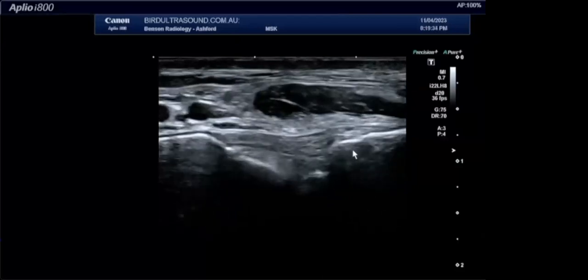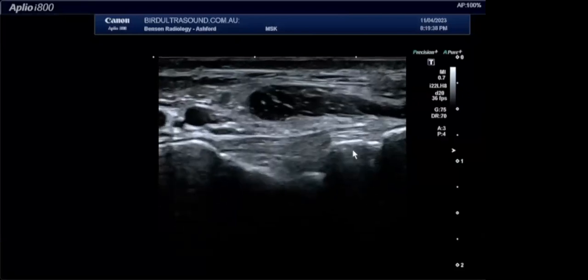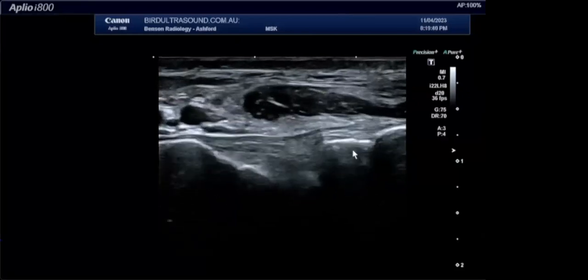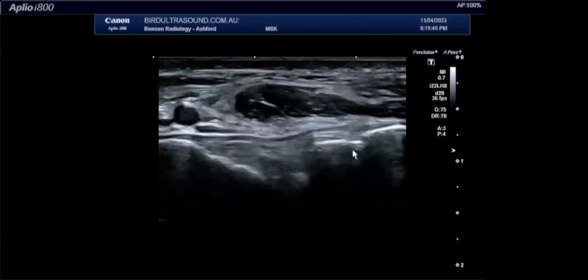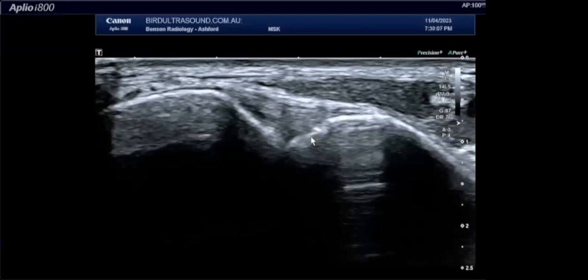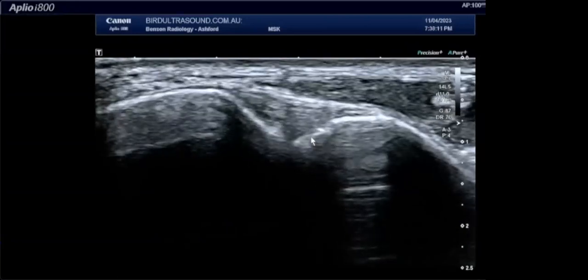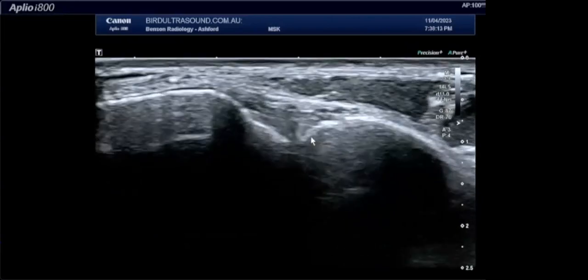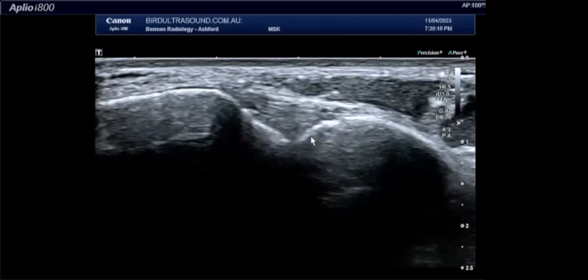And this is, of course, the syndesmotic structure that holds the tibia to the fibula. And when this fails, this is, of course, part of a disassociation between the tibia and the fibula. It's also known as a high ankle sprain. And just remember, it might also involve the posterior component, the posterior inferior tibiofibular syndesmosis, and then it may also involve a tear of the interosseous membrane between the tibia and the fibula higher up in the calf.